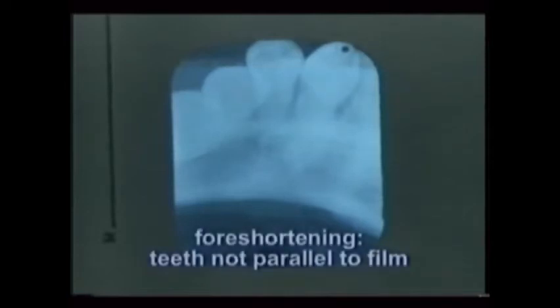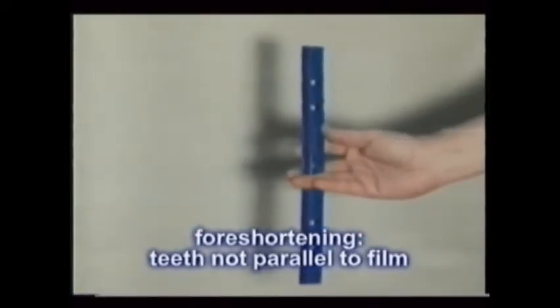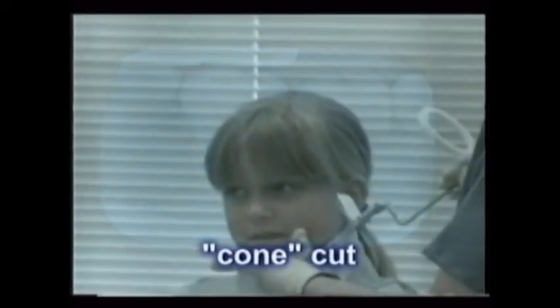Extremely short roots indicate that the teeth were not parallel to the film — this is called foreshortening. Curved white or clear areas show that a part of the film was not exposed to x-ray. The curve is the edge of the x-ray tube head, once called the cone. That's why this mistake is still commonly called a cone cut. It's practically impossible to get a cone cut while using film holders and aiming devices.